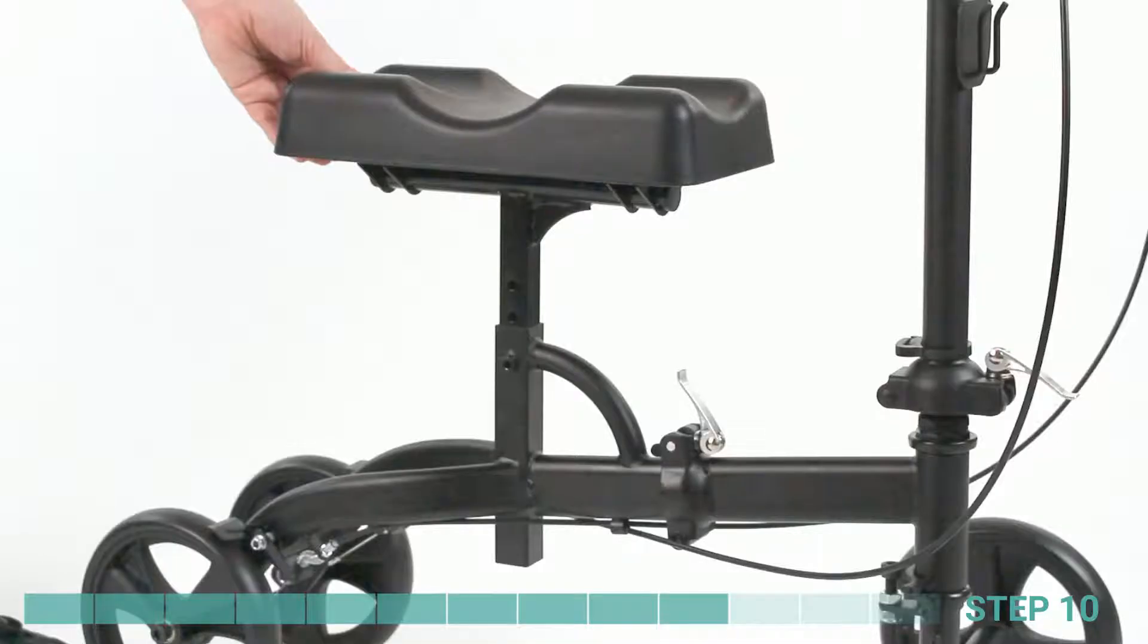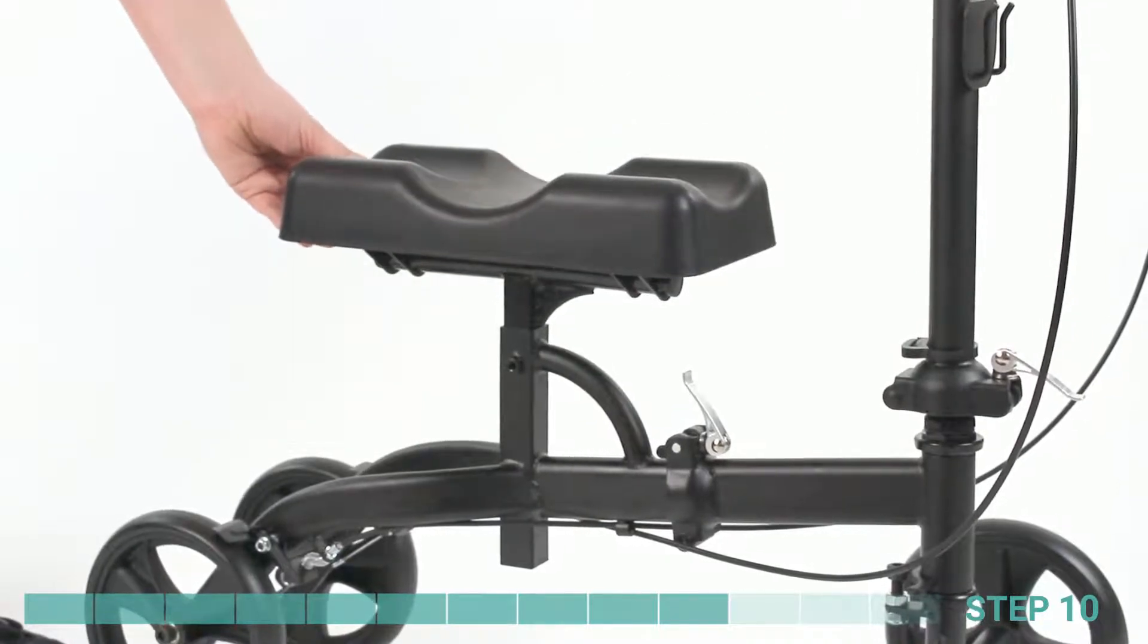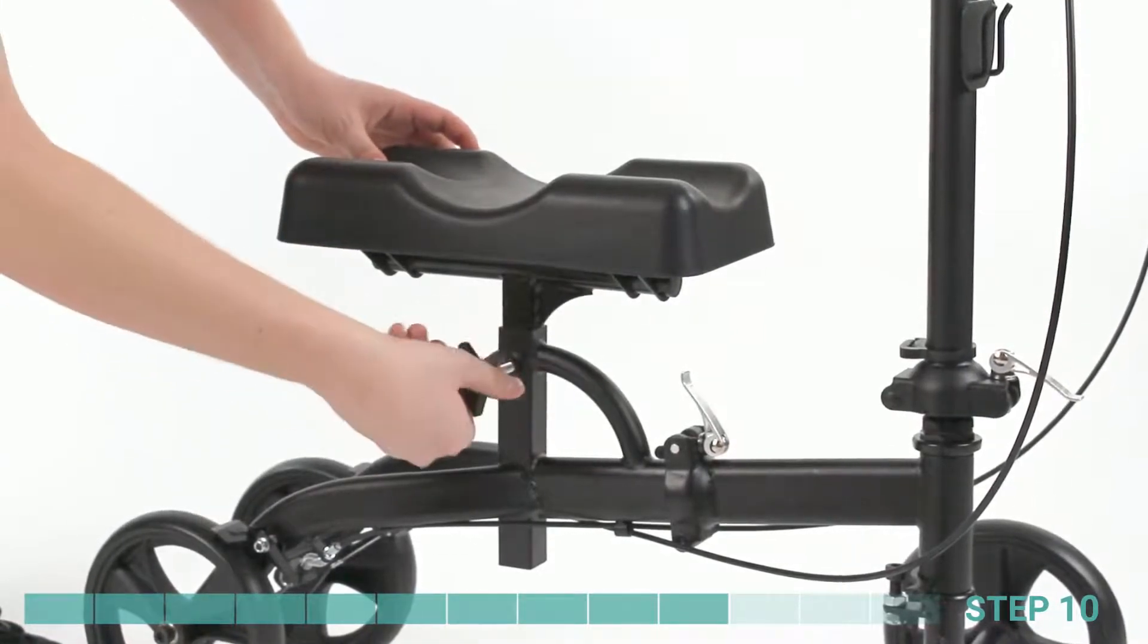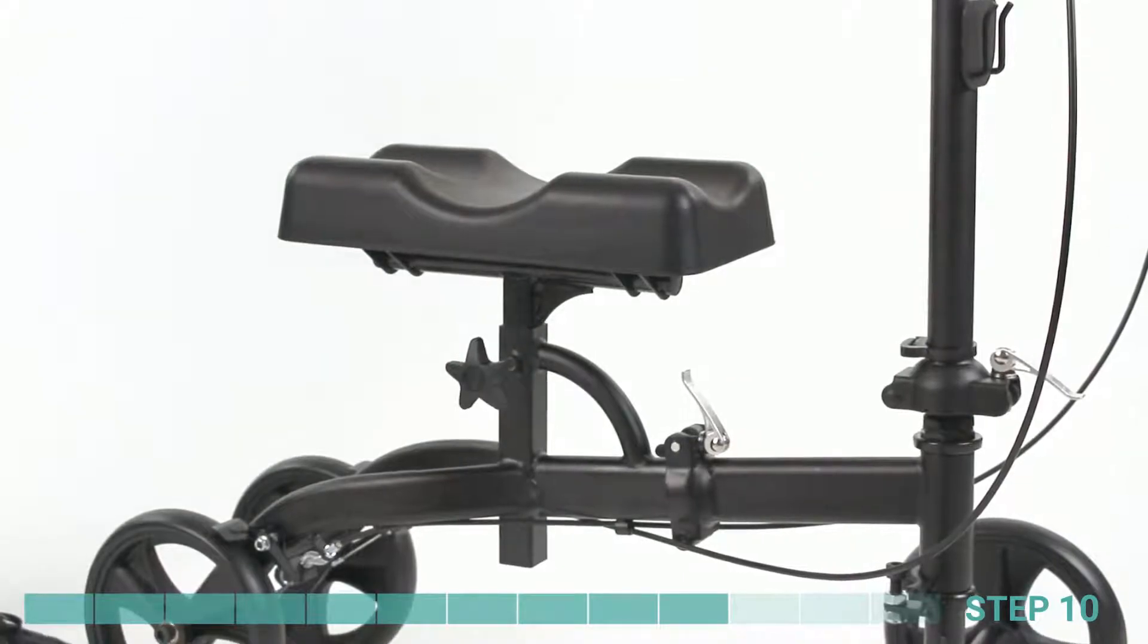Step 10. Adjust the knee pad to your desired height, lining up the hole on the knee pad pole with the hole on the base. Insert the adjustment knob back into the hole at the top of the base and tighten.